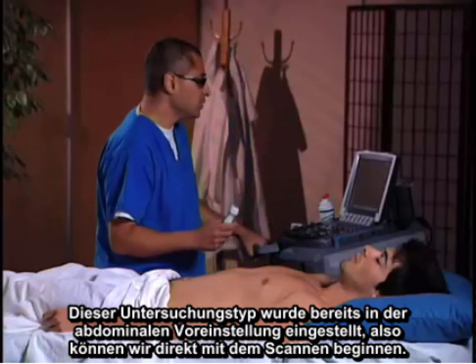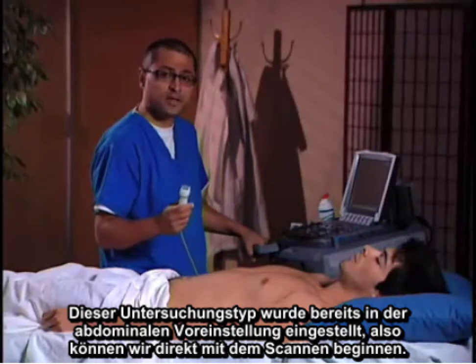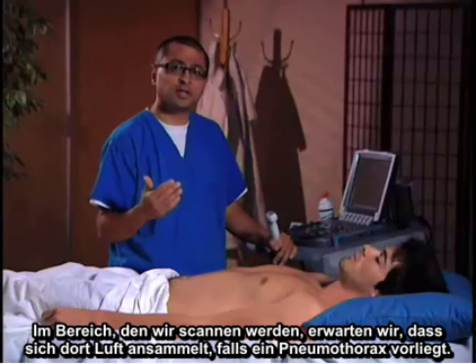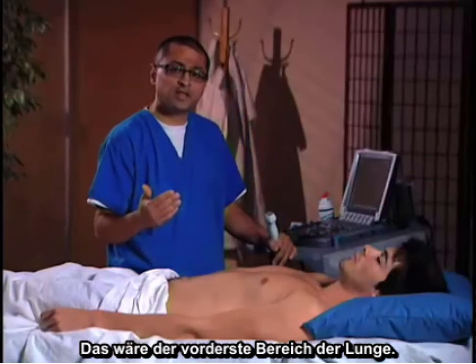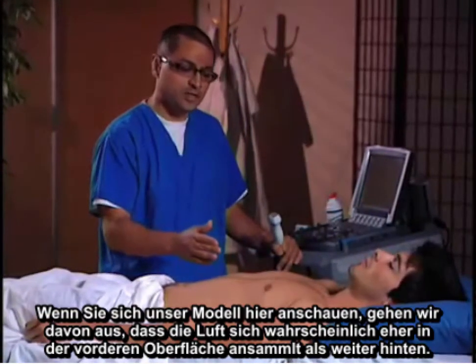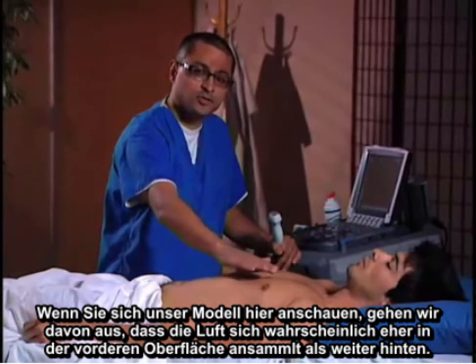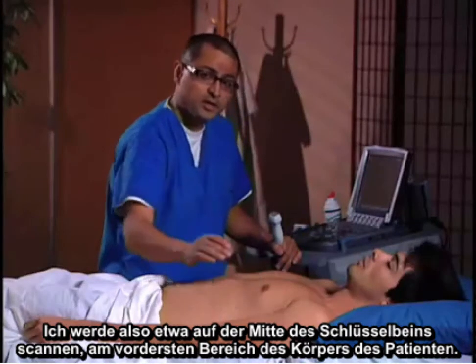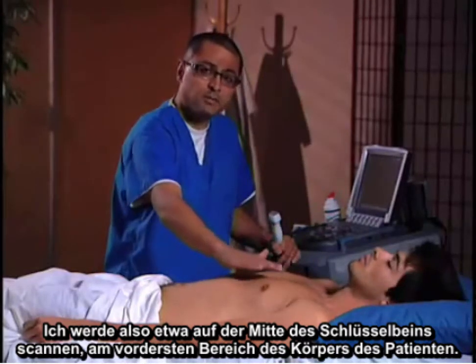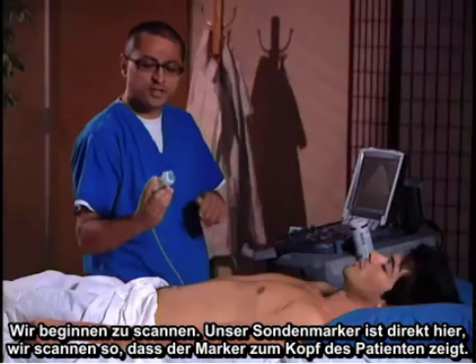The exam type has already been set up in an abdominal preset and so we're ready to start scanning. The area we're going to scan is where we'd expect air to collect in the presence of a pneumothorax — that would be the most anterior aspect of the lung. We would expect air to collect more likely on the anterior surface than posteriorly. So when I do my scanning, I'm going to scan about mid-clavicular line at the most anterior area of the patient's body.